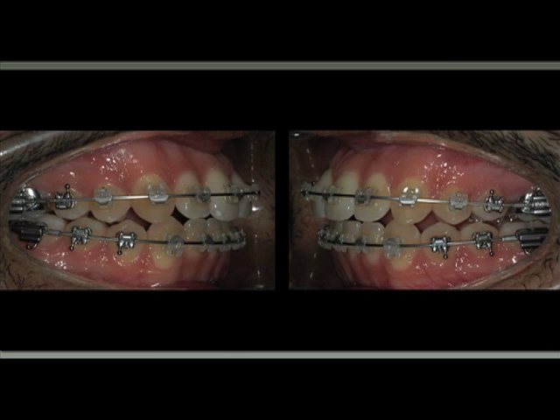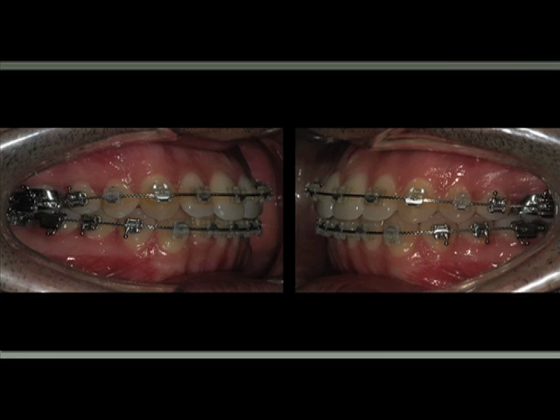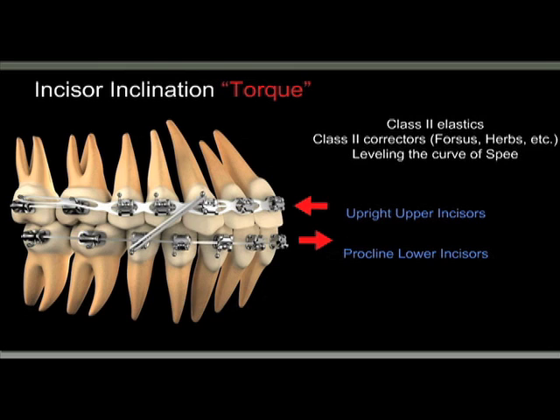So as you can see over here, what I have to do in this case is to change the bends, take them out and place them in the right place, more distal. And also I removed the transpalatal bar to re-coordinate the arches, and just by doing this, the bite closes. As you can see over here, the mandible autorotates, the bite closes, and I finished the case. That's the last arch wire, and this is after they removed the braces, with a good intercuspation.